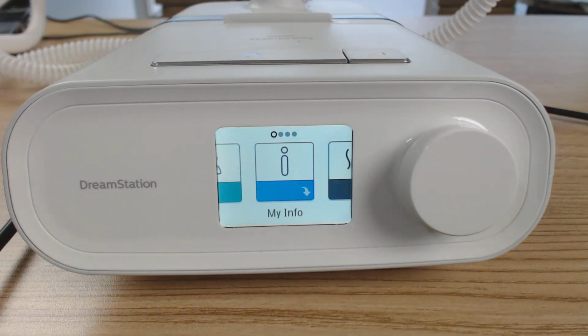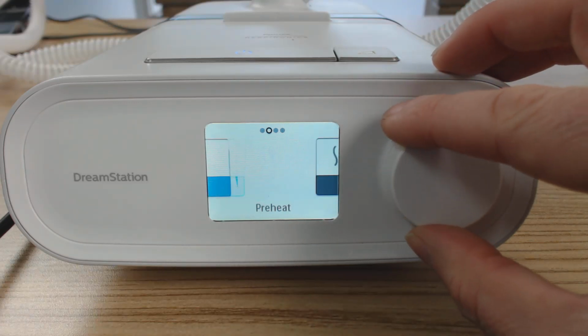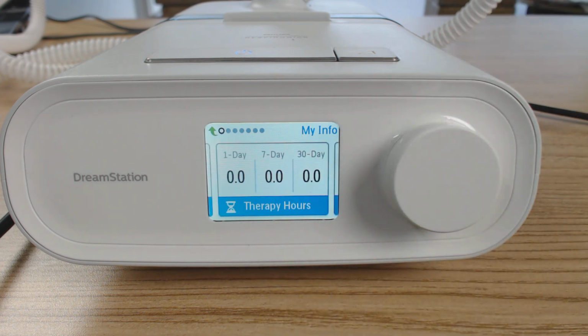Alright, so I hope you enjoyed part 2. If you've got an automatic machine, it might be a little bit different to that, but that just gives you a bit of an idea on how to go between the different menus, how to interact with them, and a bit about what they involve and what they mean.